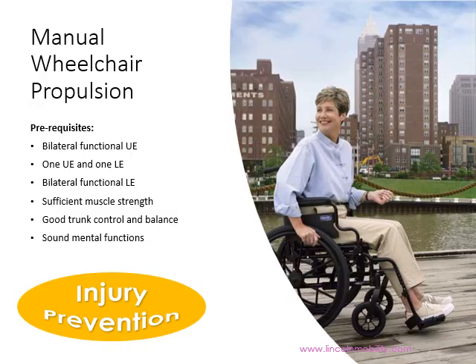To use a manual wheelchair, of course, we want our client to be independent with propulsion. It's important that they have two limbs that are functional, so either both upper extremities, both lower extremities, or one upper and one lower extremity. They also should have good trunk control and balance, and of course, sound mental functions.